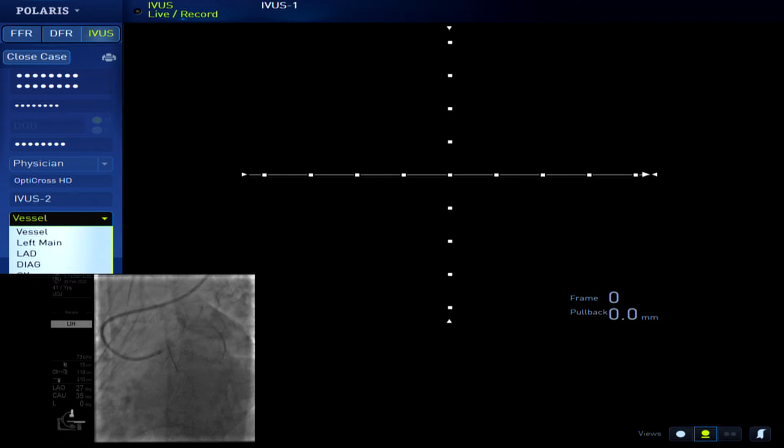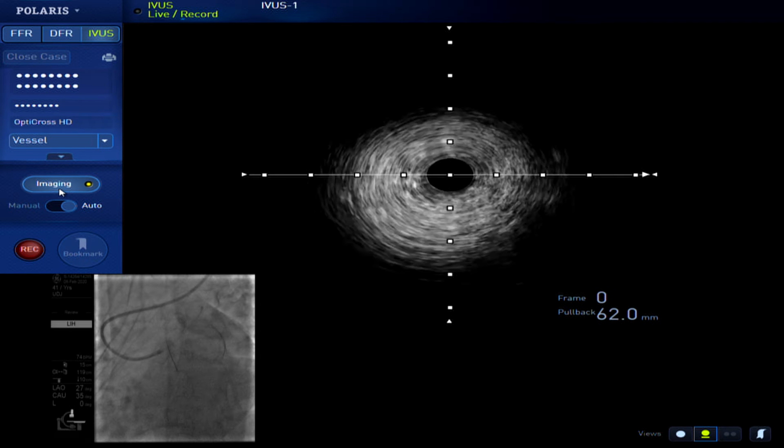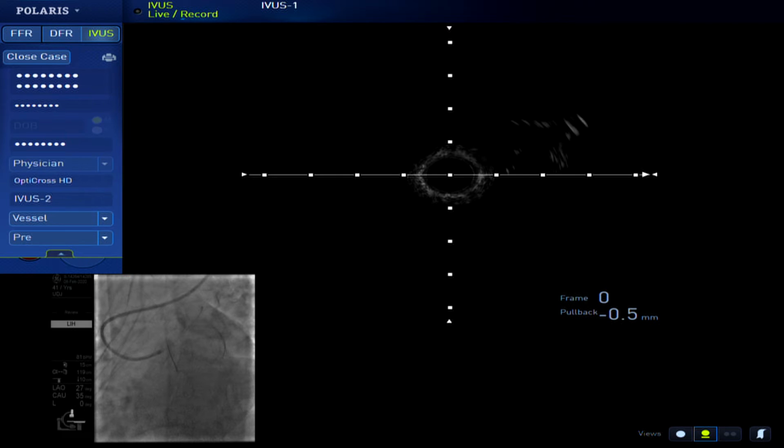Dr. Saito, do you think that further imaging is helpful here or not? I don't know, but they request, so I will do it. They're just asking. I think you have to do what you think is best. Saito-sensei, in this case, I think OCT is much better to identify the spot and wire condition. But I understand, in this room, we don't have OCT. Yes, I know. Therefore, after the pullback, you try to push in the IVUS at the site of the bifurcation, and we can confirm the wire position very well, right? Yes. Okay.